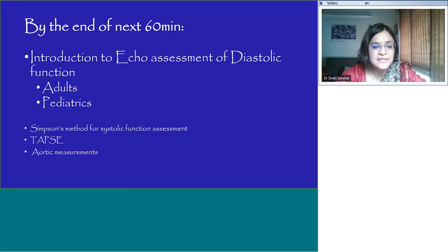Our objective is to have an introduction to echo assessment of diastolic function of the left ventricle, adults and pediatrics, and at the very end we will touch upon Simpson's method for systolic function assessment, TAPSE, aortic measurements, and any other questions.